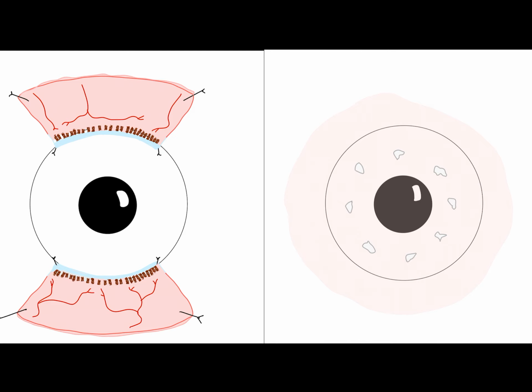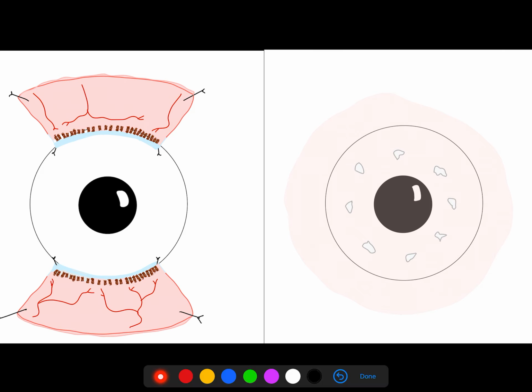So on the photograph on your left is a schematic of conjunctival limbal autografting. Now, if you pay attention to it, you will see that it consists of two lenticules. There is one lenticule on top and there is one lenticule at the bottom. This is conventionally how this surgery is done. Usually the length in terms of clock hours of each of these lenticules is about 2 to 3. There are some papers which describe 2 clock hours, some papers which describe 3 clock hours. These are taken either from the healthy fellow eye, in which case it's an autologous graft, or it is taken from a living donor.